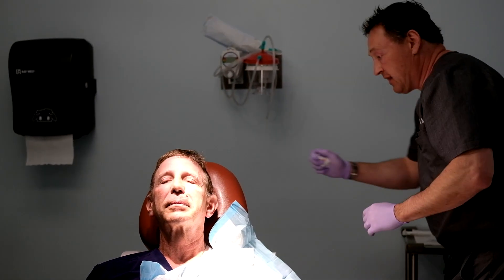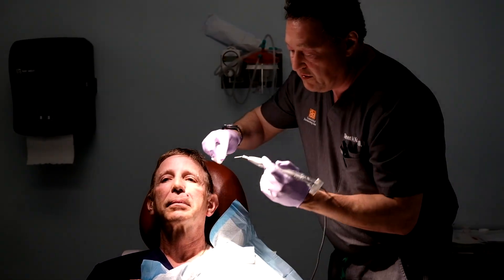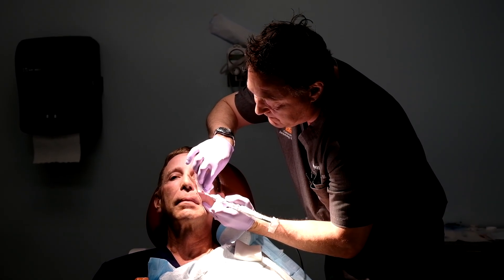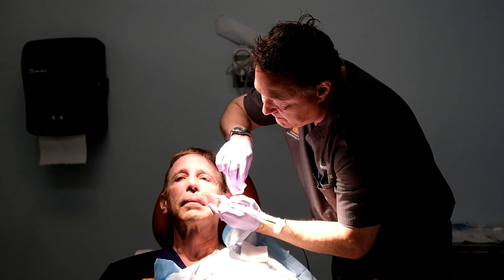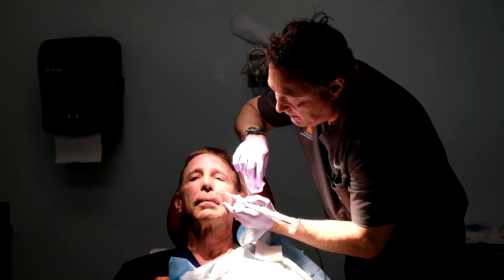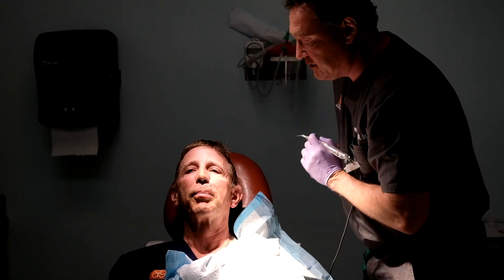Our biopsy goes in our biopsy bottle. And then to stop the bleeding, we use a little electrocautery. We'll apply a little aquaphor and a band-aid, and the biopsy procedure is completely done.